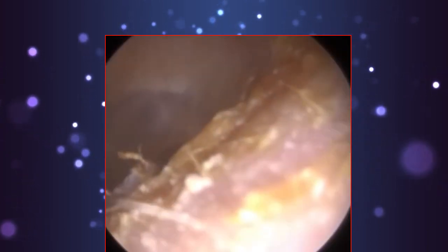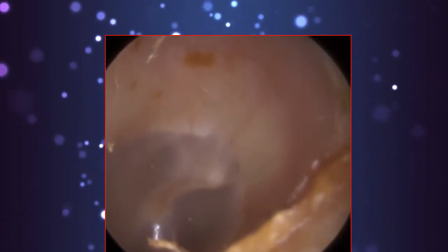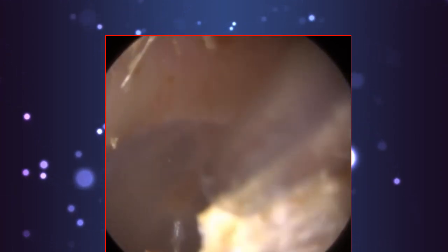So what I'm trying to do now for this patient is just peel as much dead skin off as I can. We're never going to get all this dead skin off. It's near on impossible. So we're just trying our best. And to peel this dead skin, we are having to make contact with the canal wall. And laterally, it's on the cartilaginous portion of the ear canal. And we can apply a bit of pressure because that's cartilage. It's semi-sensitive. Doesn't mean that it's non-sensitive. If you're quite aggressive in the outer cartilaginous portion, it can still cause a bit of injury and trauma. It can be unpleasant for the patient.